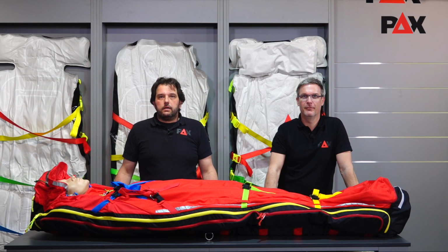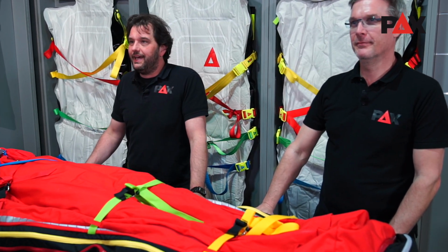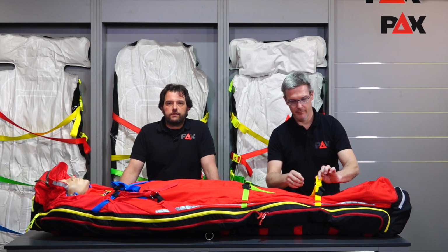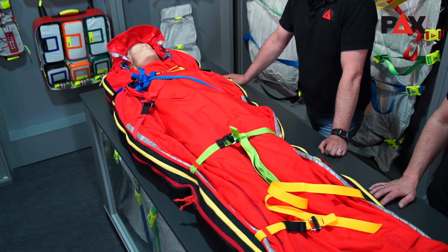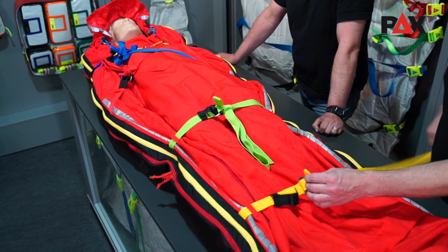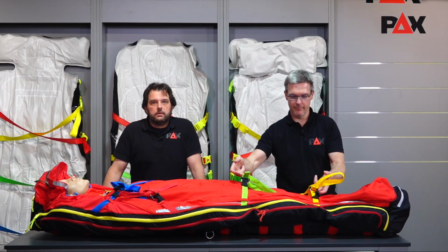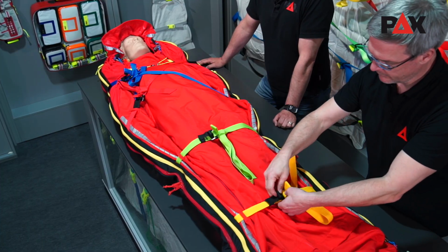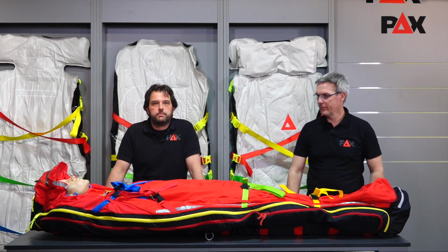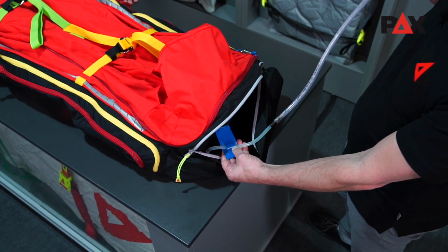The compression straps are also color-coded. In the upper body area, the blue and the red straps are crossed and fastened over the roller buckle. Optionally, a safety device for the roller buckle can be inserted. The loop's end is knotted, so it is secured during the flight. The 2 lower body and leg straps in green and yellow are lashed in parallel and secured in the same way. The roller buckle holders are each designed to match the color of the lashing strap to avoid confusion as far as possible. The padded pouch at the foot end for the vacuum pump has a feed-through for the tube pre-connected to the vacuum mattress.